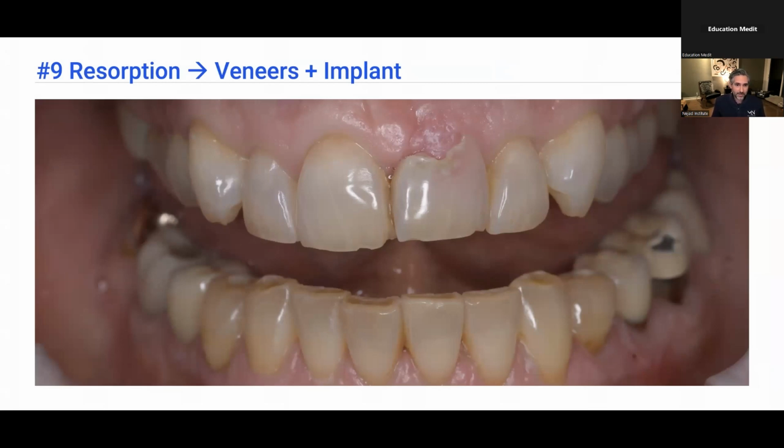So this patient came to my clinic well aware of the resorption on number 9, but also realizing that in treating this tooth, she also wanted to improve her smile. So there's a big treatment here. We reviewed plans, we did our designs, and basically determined that to get the goal to improve her smile, we'd be doing 10 restorations, one of them being an implant and the rest being partial coverage ceramic restorations or veneers.